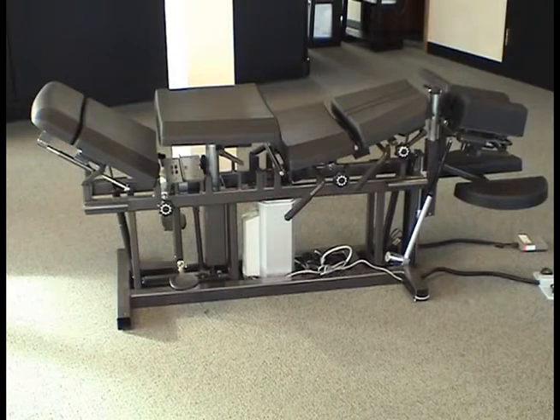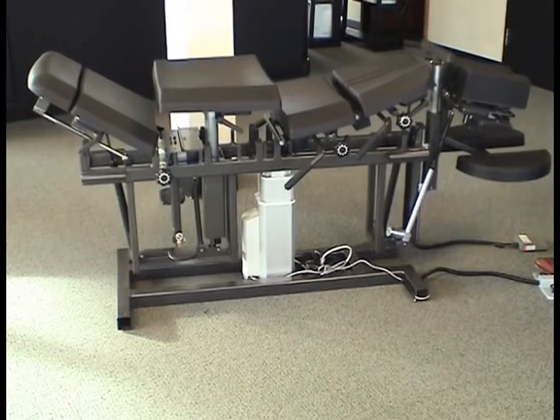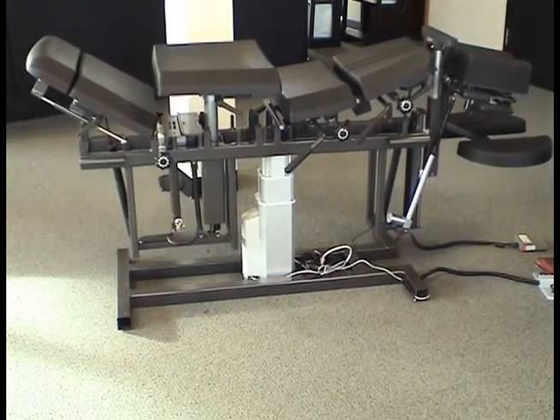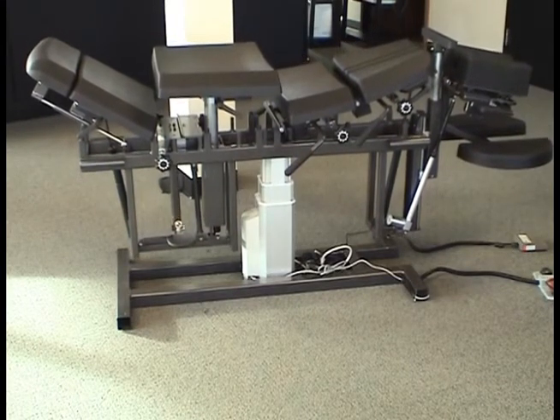Table specifications. The weight of the PCT table is approximately 325 pounds, of course dependent on which options are on the table. The height of the table, when stationary, is 21½ inches off the floor when the frame is flush to the floor. The electric elevation table will travel from 21½ inches off the floor to 29.5 inches off the floor, again when the frame is flush to the floor. The width of the table is 21 inches at its widest. The length of the table is 77 inches.